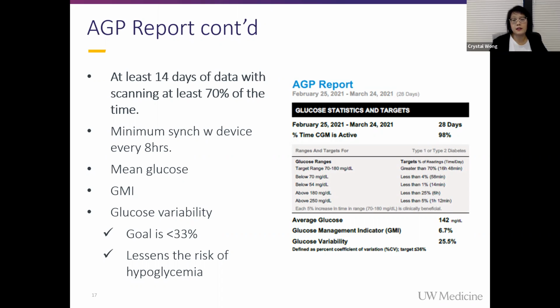They have to sync the device at least every 8 hours. That's just how much data the sensor stores. If they go beyond that, they're going to lose their data. It's very easy to sync. You literally just take your phone and hold it up to your arm. So hopefully that's not going to be a huge barrier for patients.